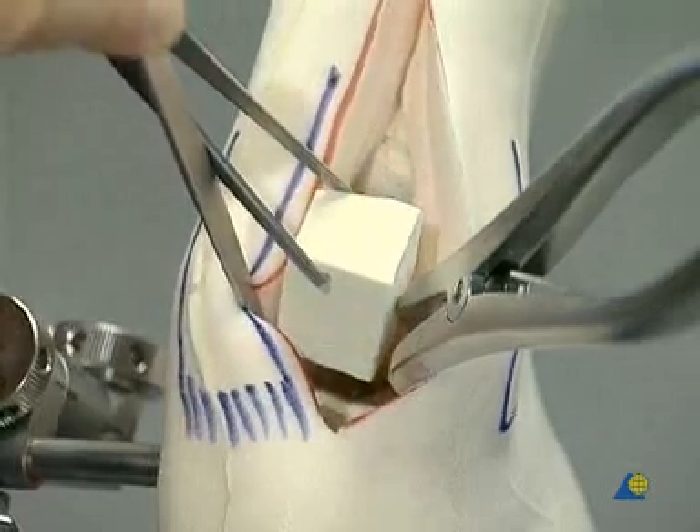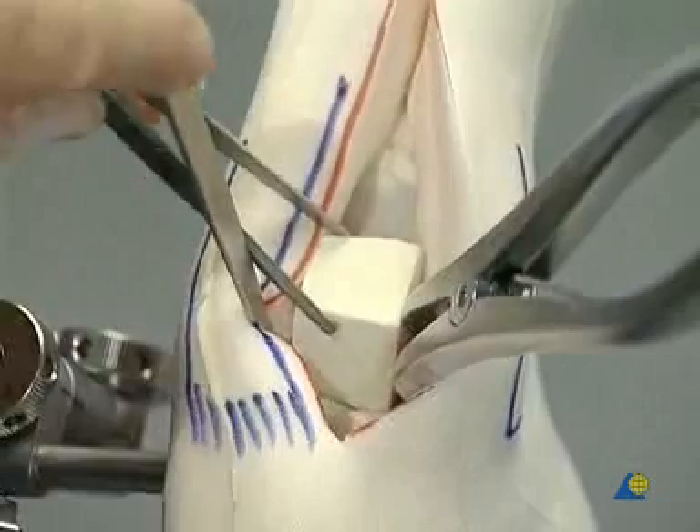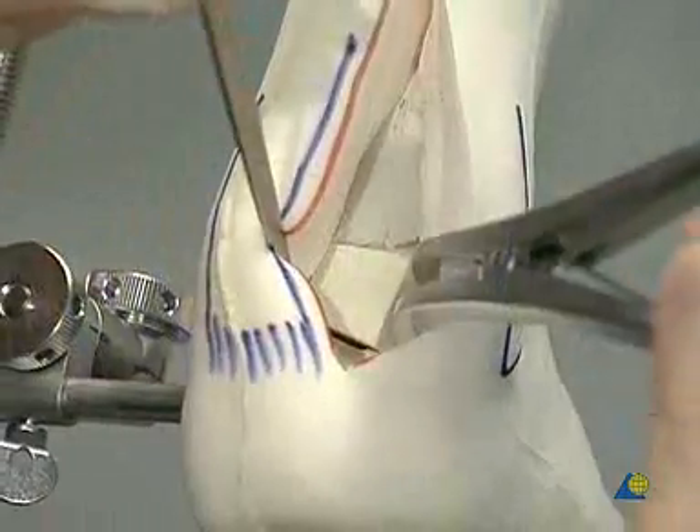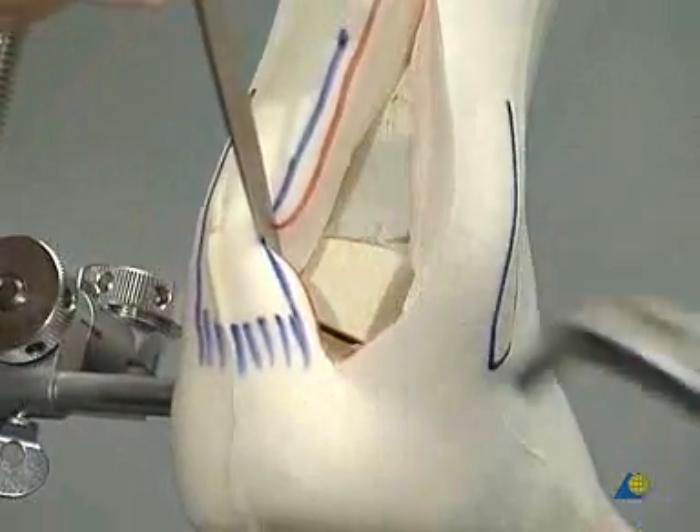The block is introduced into the prepared space. It is impacted using a cancellous bone impactor and a hammer. The bone spreader is removed and final impaction is carried out.